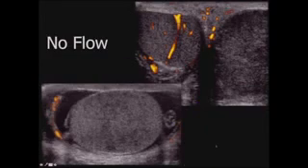Just more images again. I usually always start with the asymptomatic side, one, to gain the confidence and trust of the child before moving to the tender side, but also to make sure that I've got sufficient technical parameters to detect flow if it's there. So once I've detected flow in the asymptomatic side, I move to the other side. Little doubt about this one, very heterogeneous necrotic testis. This one with a little more heterogeneous echo texture, but again, I can get flow in paratesticular structures, but no flow within the testis itself.